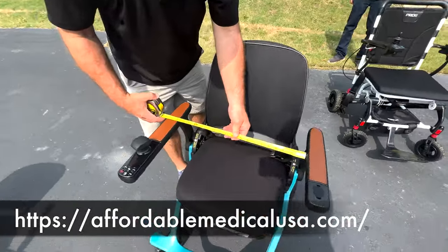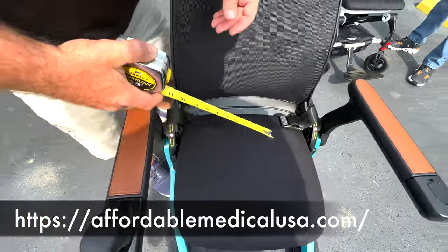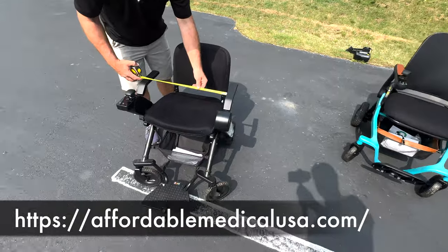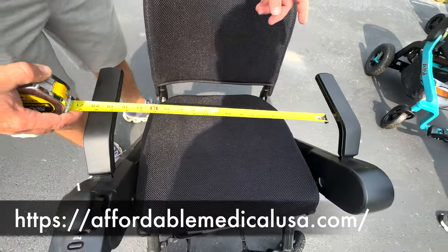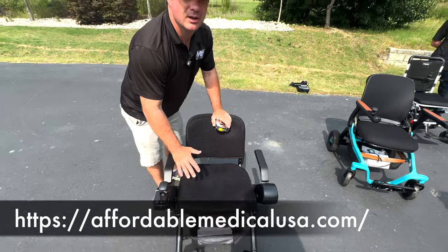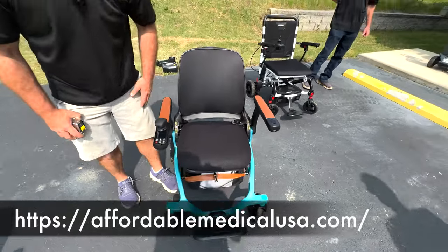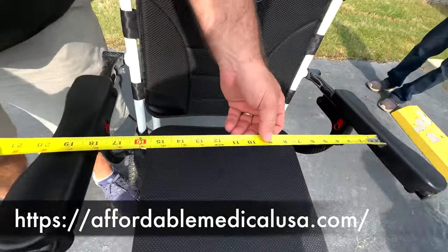But I will say, between the arms on this one's almost 19 inches, 18 and a half. This one's 325 pounds. This one, I believe, is, let's say, 275, I forgot. That's surprising a little bit. That's 19. But your legs can compress to the side, where this one's open. So if you are a little bit larger, you have room out here. It's not pushing on your sides. And then over here between the arms, it's about 18.